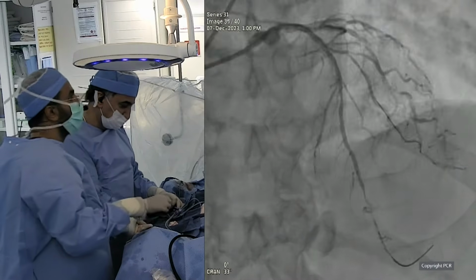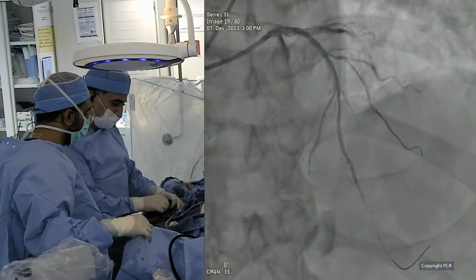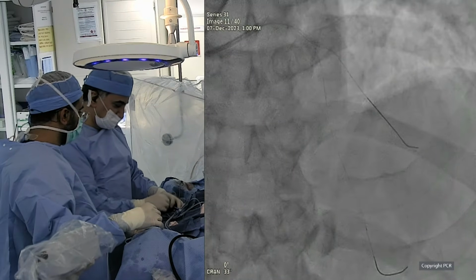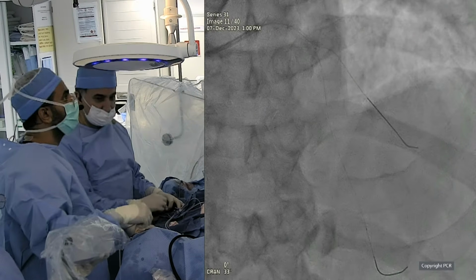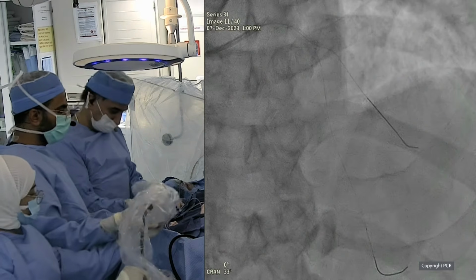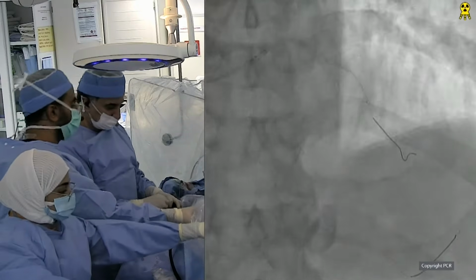So at this point, it's very important not to push, but to handle the catheter and try to sit a little bit more properly to get the best imaging possible, because we wanted to get only one pullback. You remember it is 55 of eGFR in 135, so we needed to minimize also the contrast in this case.